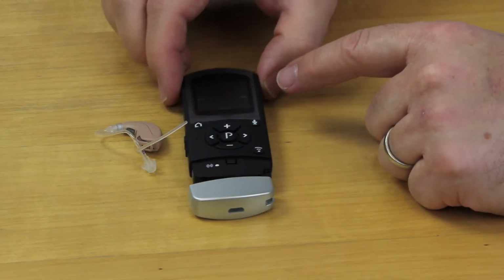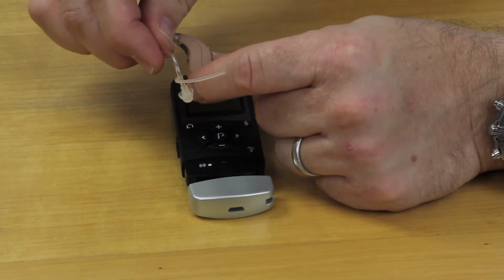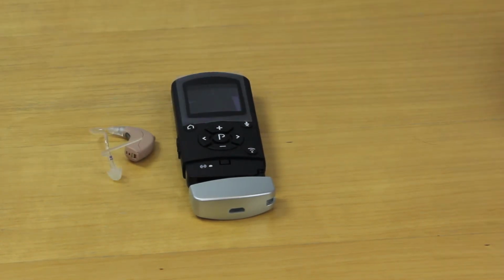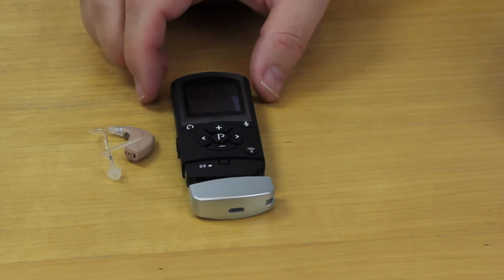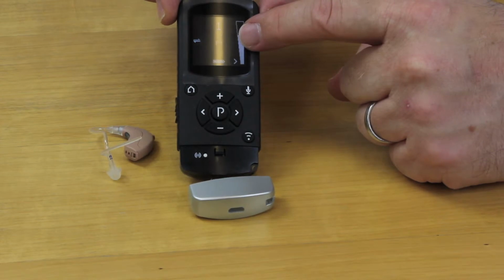Whilst pairing mode is activated, close the battery doors of one or both hearing instruments and make sure they are on. A successful pairing will be indicated by an audible melody played in both hearing instruments. You only need to do the pairing procedure once.